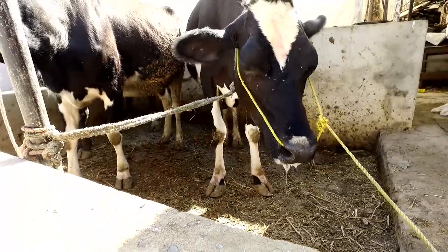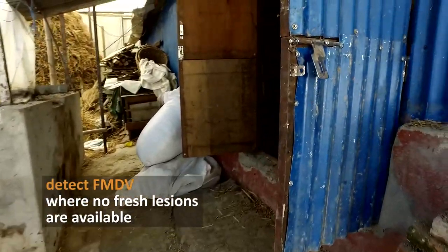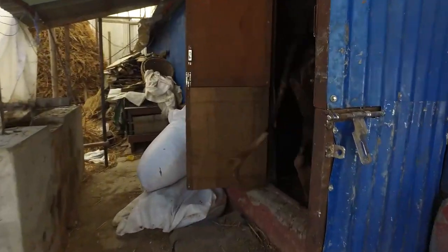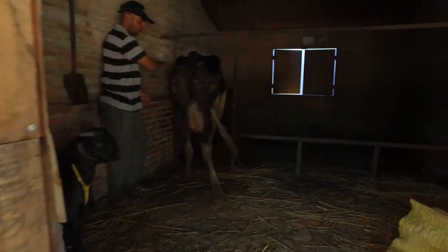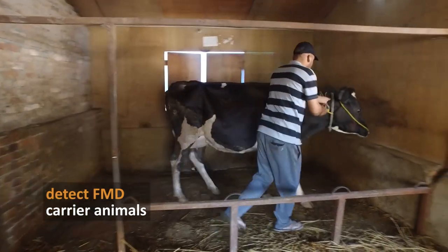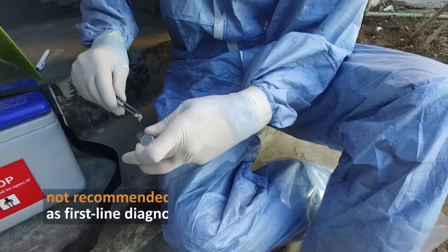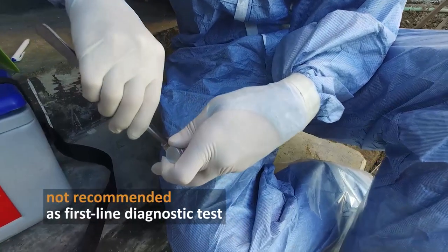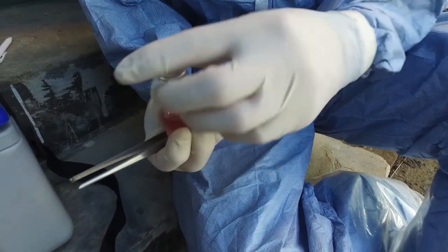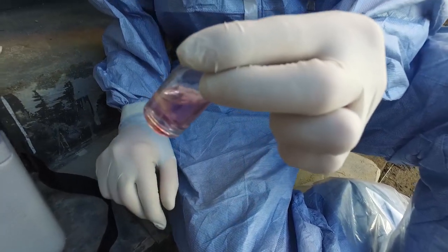Probang sampling is useful for detection of FMD virus in suspect cases where the disease is expected to have occurred over one week ago and there are no fresh lesions to sample. It is also used to detect long-term FMD carrier animals. It should be noted that probang sampling is not usually recommended as a first-line diagnostic test, as it is preferable to collect vesicular epithelium or vesicular fluid where these can be obtained from fresh lesions.